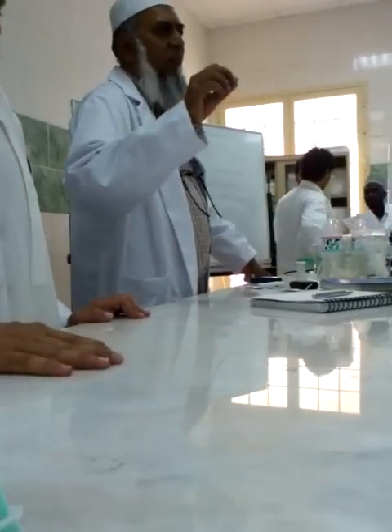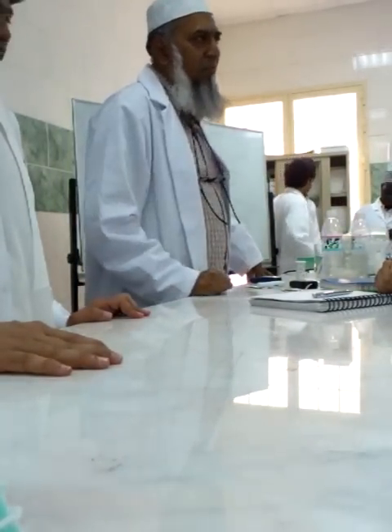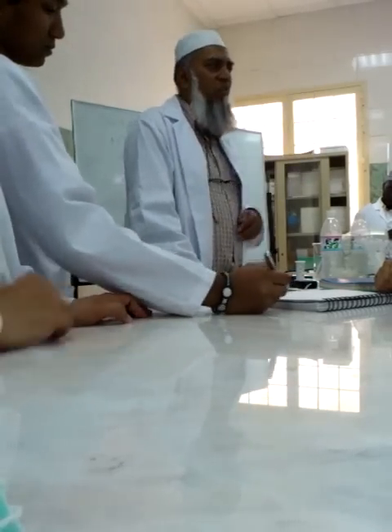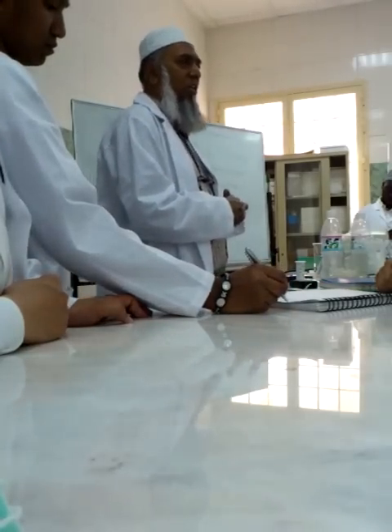Now suppose you write this result that 522 before exercise and 542 after exercise. And the examiner will ask you that okay, the effect of exercise is to reduce the glucose level, but here in this case the glucose level is increased, not decreased.